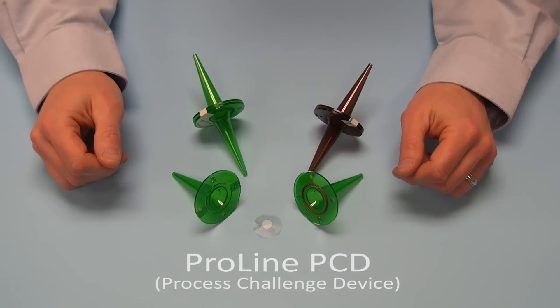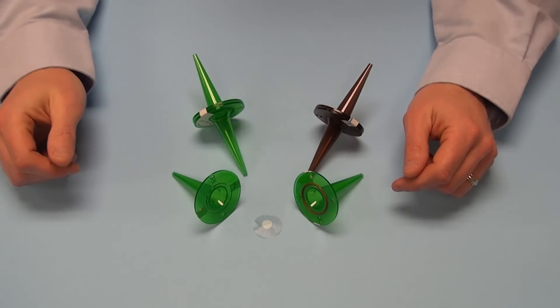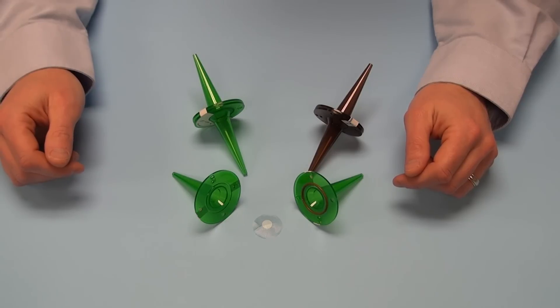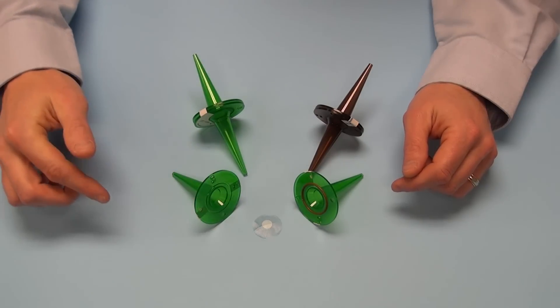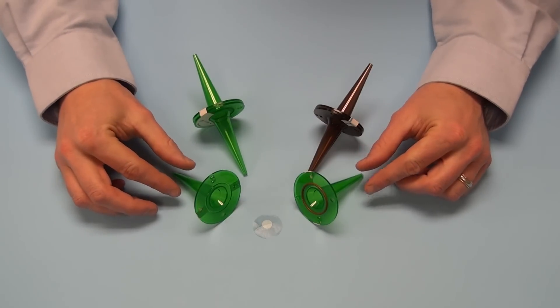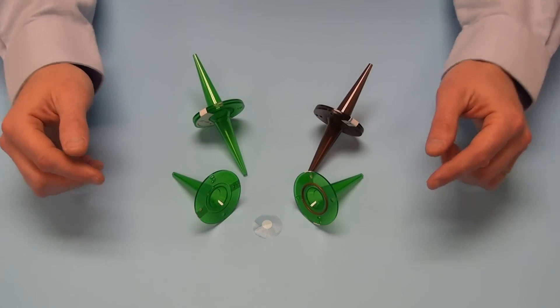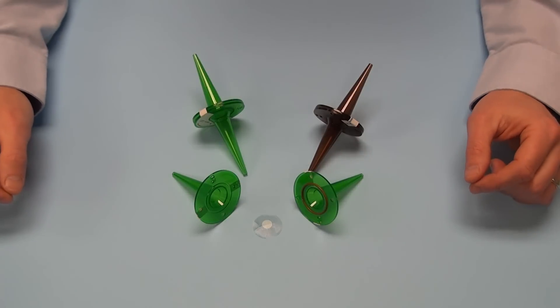The ProLine PCD, or process challenge device, contains a filter paper disc which is inoculated with bacterial spores — either Geobacillus stearothermophilus for steam or Bacillus atrophaeus for ethylene oxide sterilization. The spore disc is packaged in a glassine envelope and located at the center of the ProLine housing. The whole goal here is to force the sterilant to go through the tubing, through the cones, to get to the biological indicator.